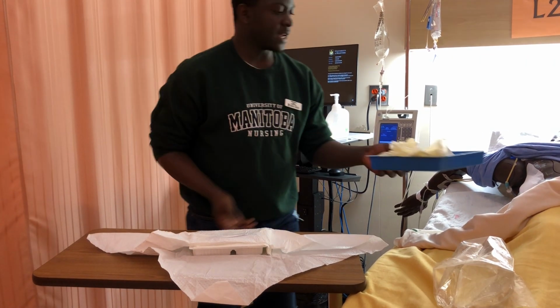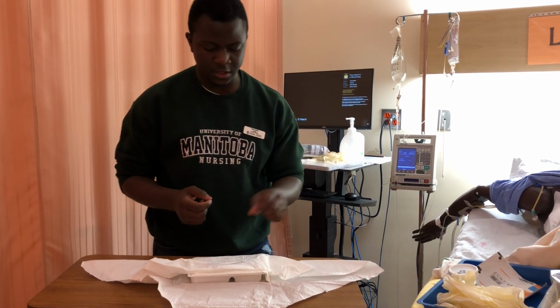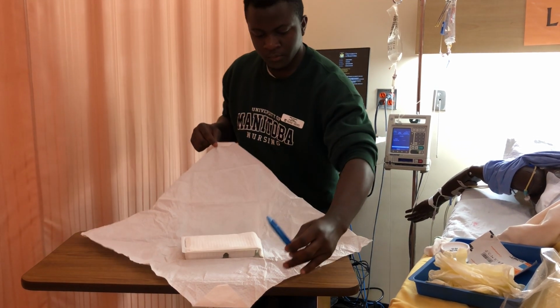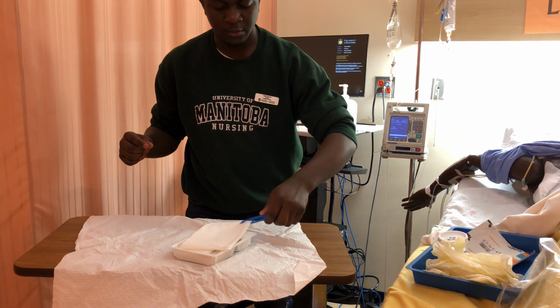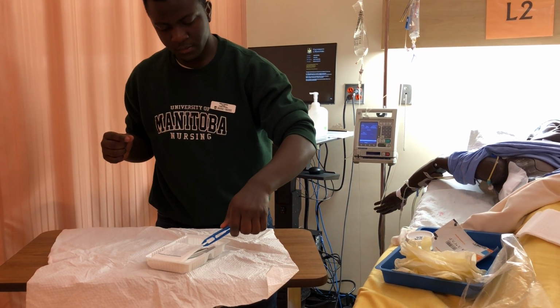So I can just ask the patient if it's okay to put this on his bed, and he's okay with that, so I'm just going to leave that on his bed. I'm going to follow it to here. I'm going to turn it, it's going to go on R, and I'm going to leave it here. Just make sure to maintain sterility throughout my procedure, and leave that on the patient's bed.